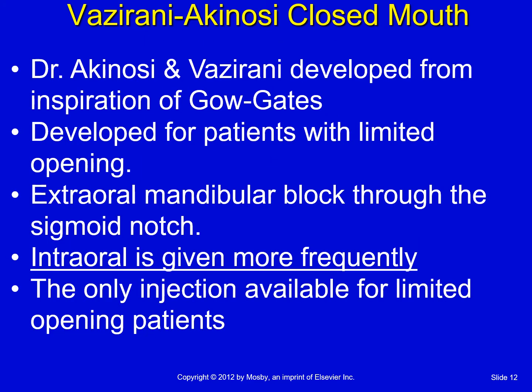I added this injection along with the Gow-Gates. This is called the Vazirani-Akinosi. This is a complete closed mouth injection. Dr. Akinosi and Dr. Vazirani developed this from the inspiration that they had from the Gow-Gates. And so they realized that you can't give the Gow-Gates to people with limited opening, so they developed an injection that you could give to patients that had a very limited opening or couldn't open their mouth hardly at all.